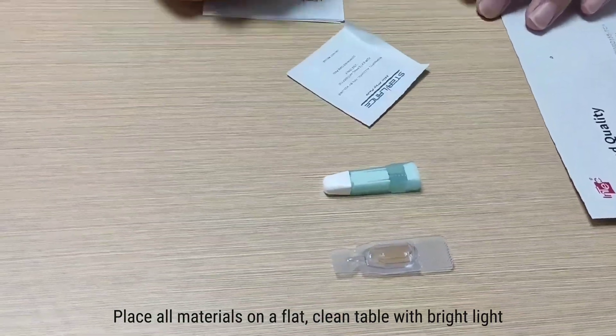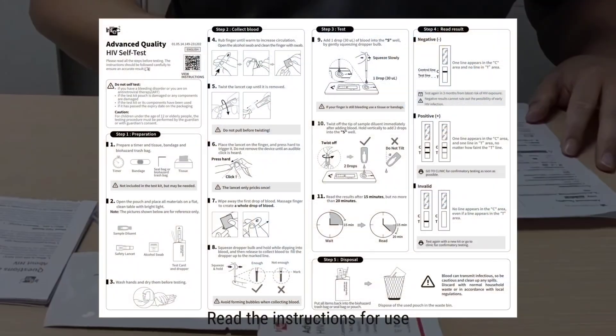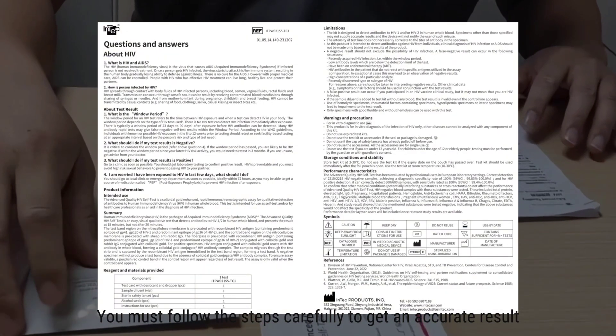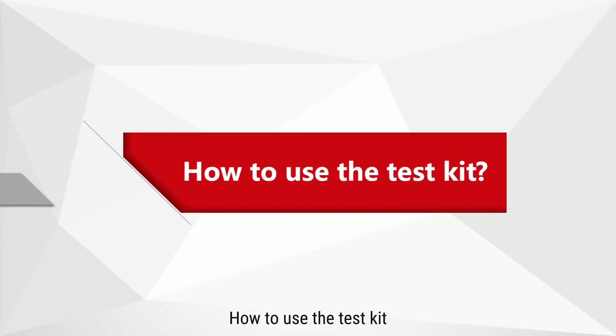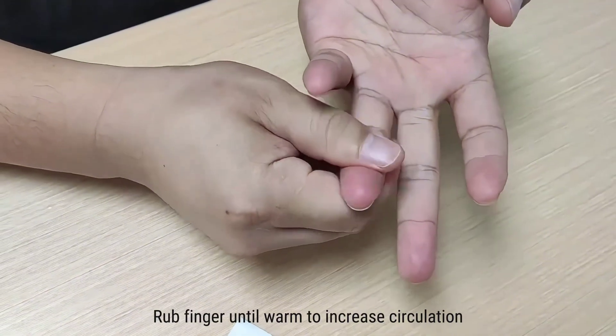a flat, clean table with bright light. Read the instructions for use. You must follow the steps carefully to get an accurate result. To use the test kit, wash your hands and dry them before testing.